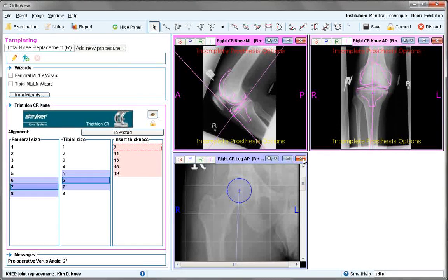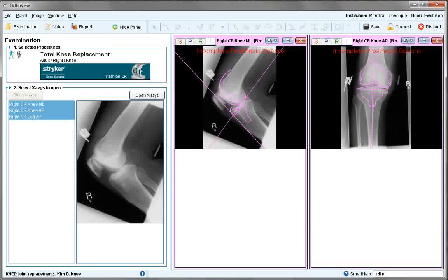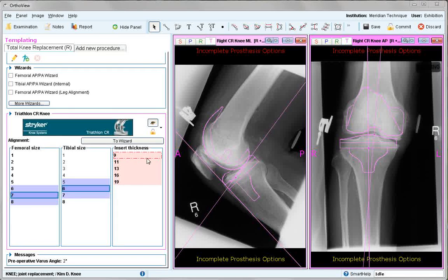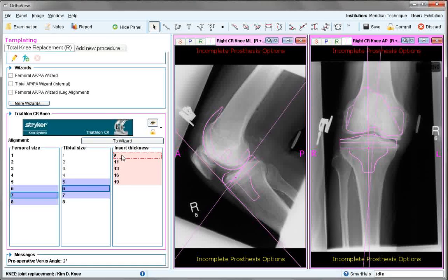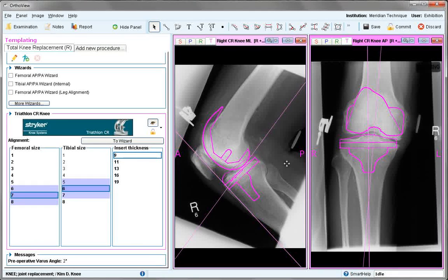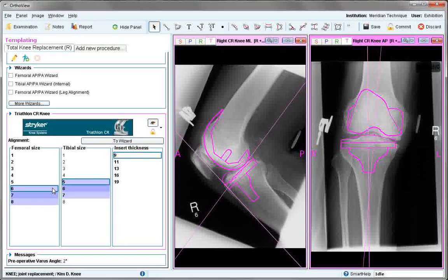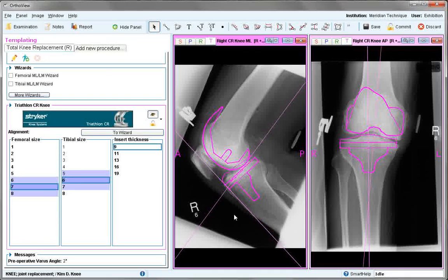As the long leg image is not going to be used for templating, it is closed. Size suggestions are recommended in templating shown in dark blue and light blue as shoulder sizes. Insert thickness has not yet been selected and needs to be specified, otherwise incomplete prosthesis options will be shown. Choosing the smallest value, the templates now become dark. Sizes can be tested; however, sizes five and seven are incompatible, so a size change would also have to be made in the femoral component, which may not be practical. When happy with the case, you can save or commit to the packs.